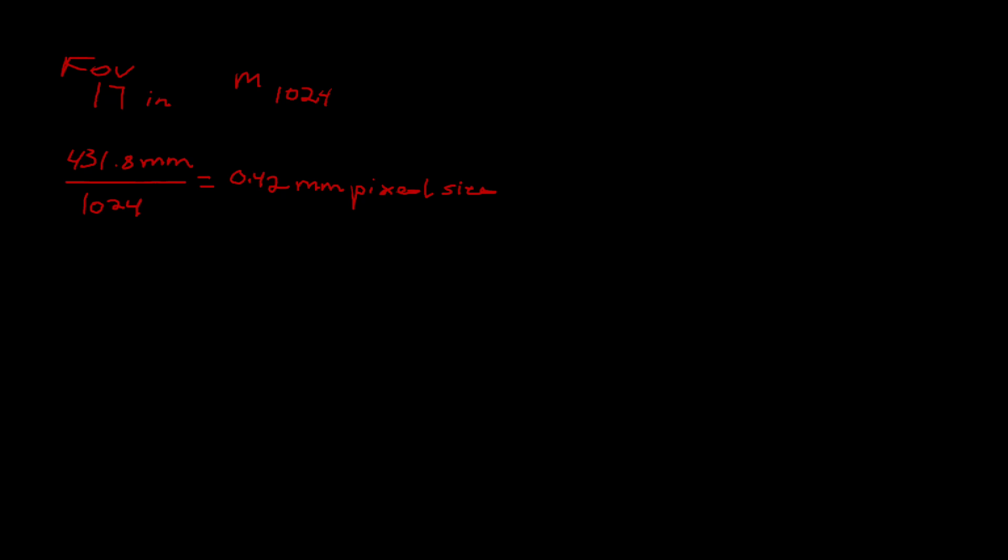Now, if we were to decrease the field of view to 12 inches, let's see what that would be. So here's our field of view, which is 12 inches. We will need to convert that to millimeters. So converting that to millimeters would be 304.8 millimeters.